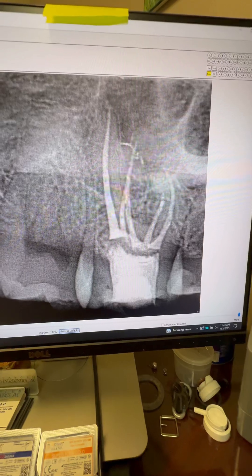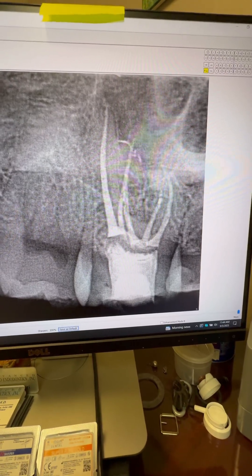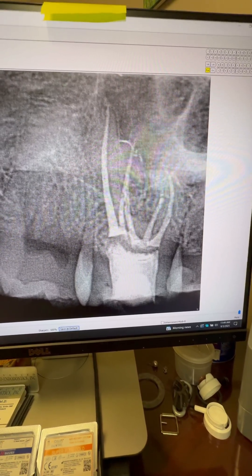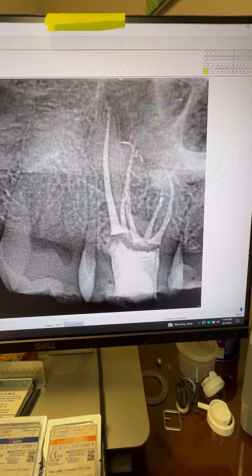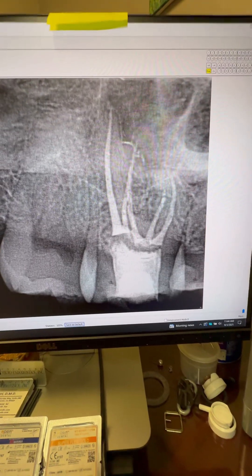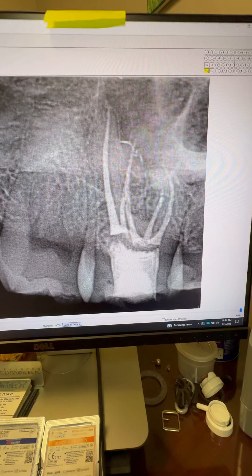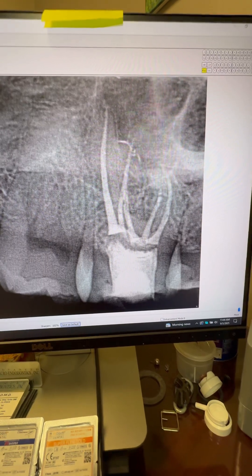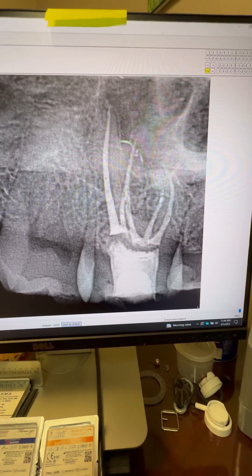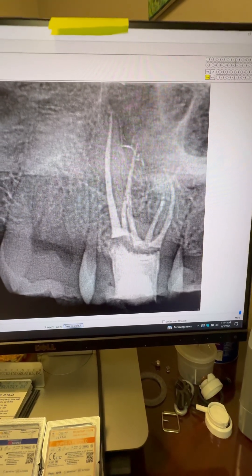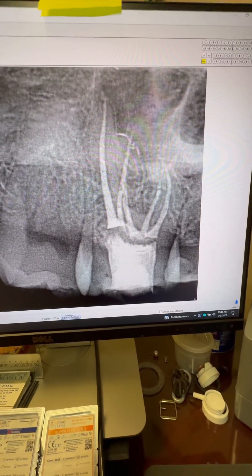As you can see, everything went great. We temporized the tooth and referred the patient back to her dentist for the permanent restoration. But with these teeth, unfortunately, with inflammatory resorption, hopefully once we do the root canal the inflammatory resorption stops — but sometimes it doesn't. So the patient is aware that the prognosis for the tooth is guarded.